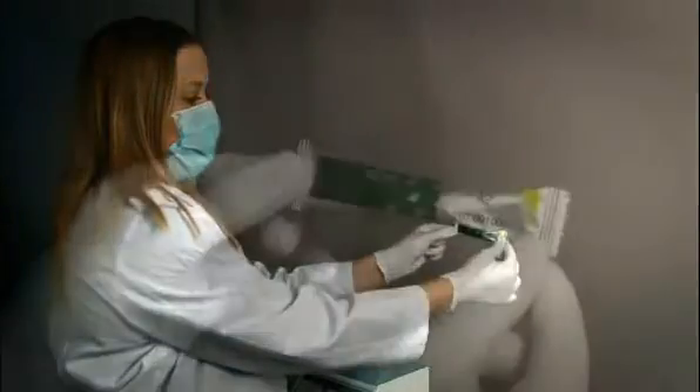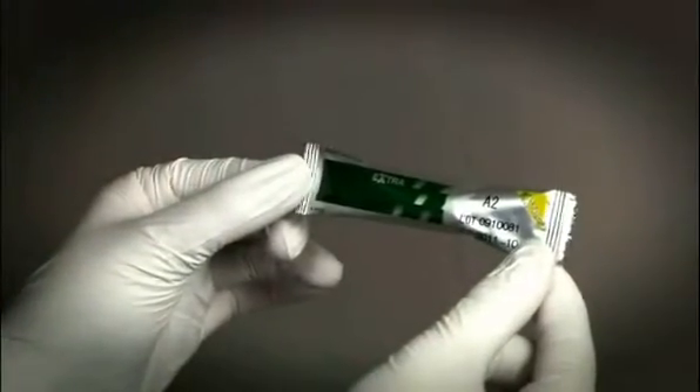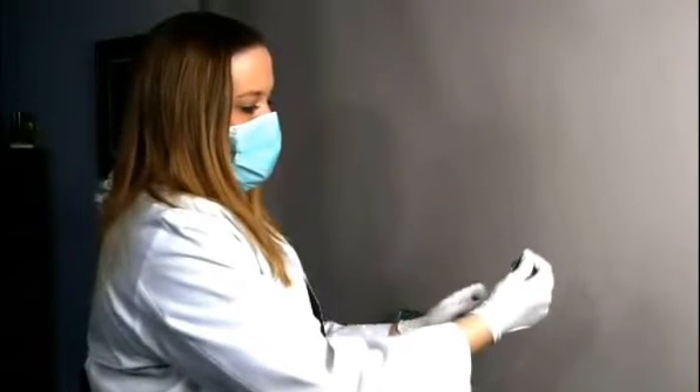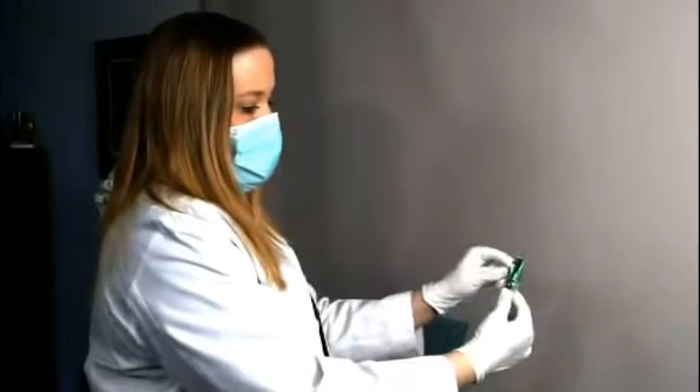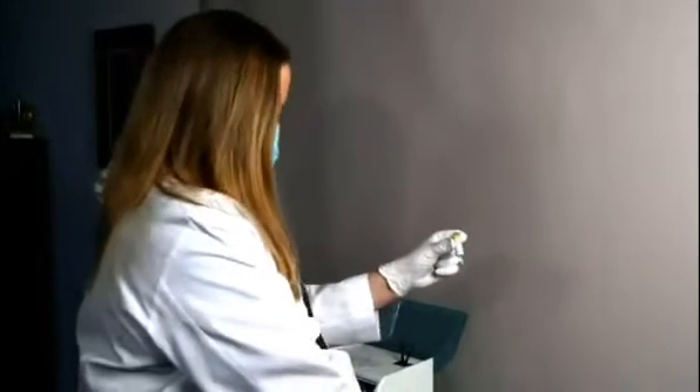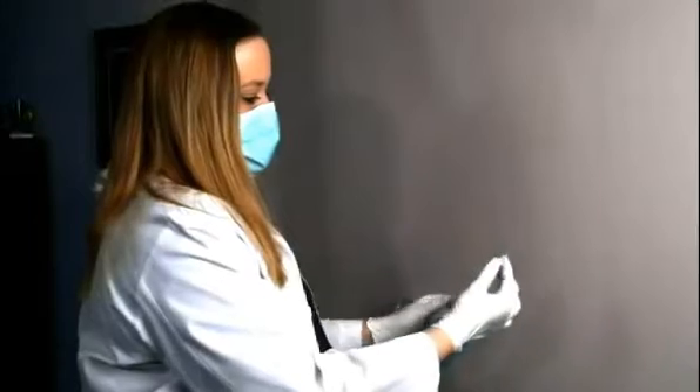A glass ionomer, Fuji 9 GP Extra, was selected for this restorative treatment. This system has eight shades, and this wide variety of shades can provide an optimal color integration with tooth structure.